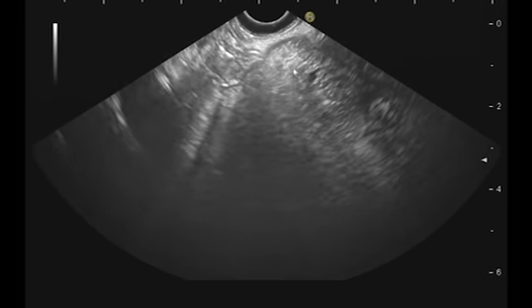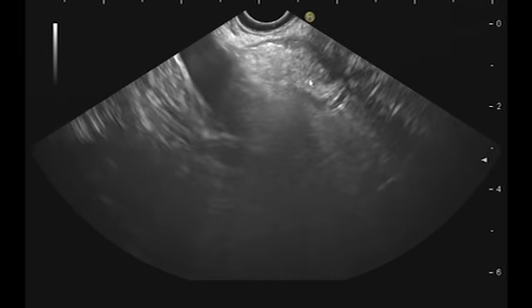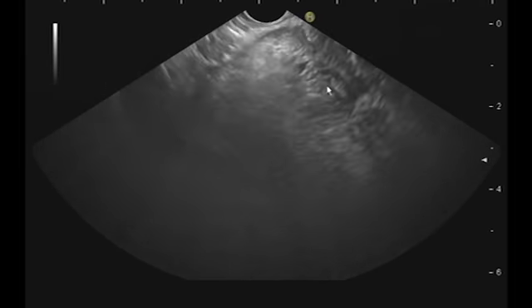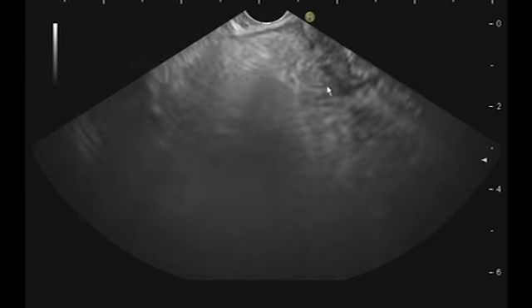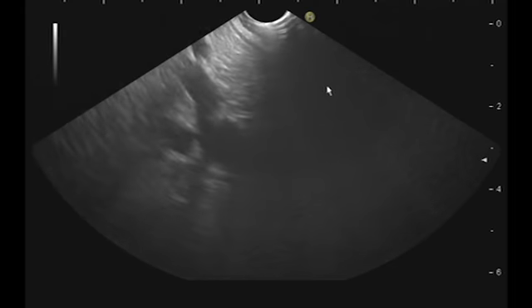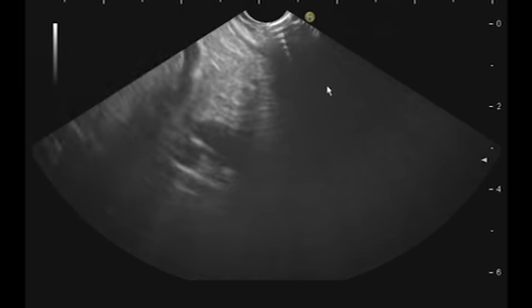Here we are at the level of the head of the pancreas, and here we have the inferior vena cava. This is the duodenal wall, and this is the papilla area. Now I remove a little bit the probe, and I push, I do up and I push my scope to try to see the papilla. A good landmark in this case will be the stent, because the stent is in the bile duct. But this also can introduce some artifact. But the plastic stent is less a problem than the metallic stent.